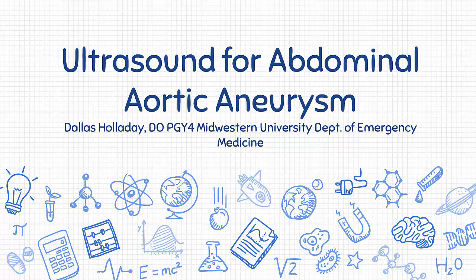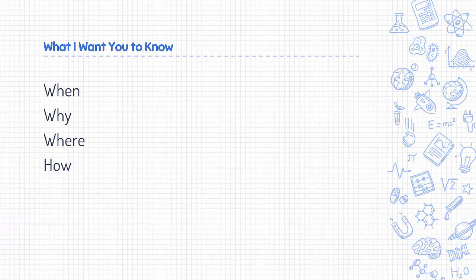This video is a tutorial for performing bedside ultrasound to assess the abdominal aorta for aneurysm. The purpose of this lecture is for you, the viewer, to understand when to perform ultrasound for AAA, how to perform the ultrasound, why we perform bedside ultrasound, and some troubleshooting tips.